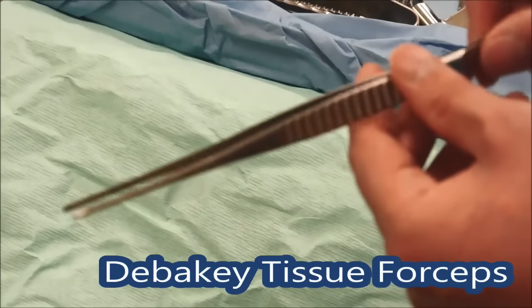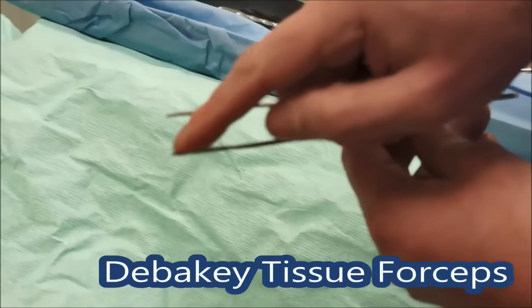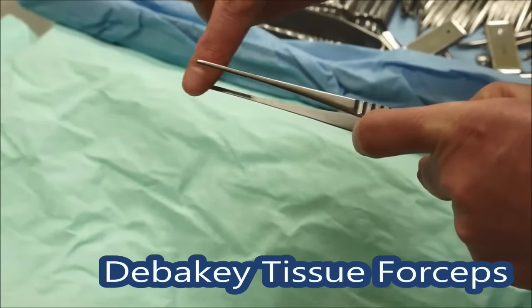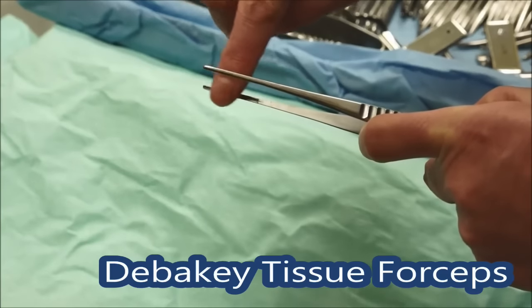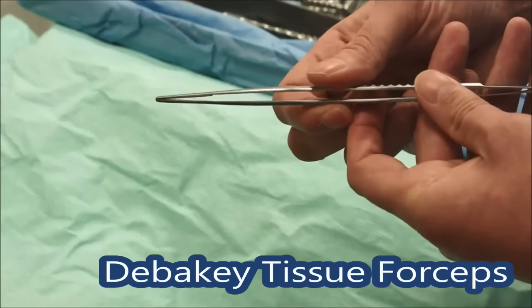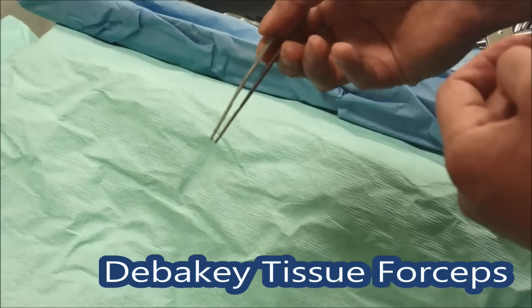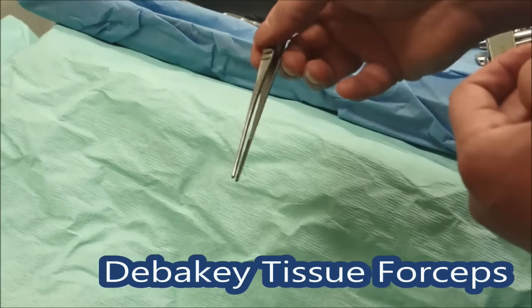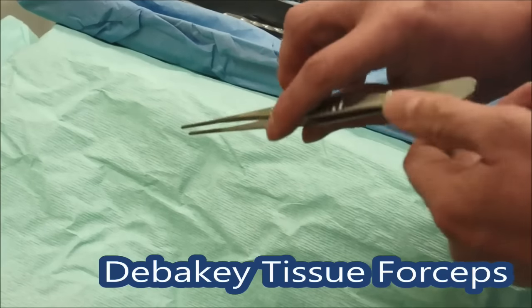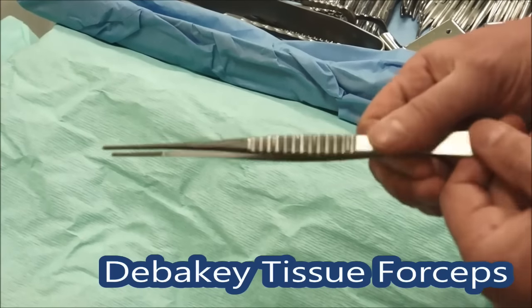Next we've got a long pair of DeBakey forceps. These are quite atraumatic forceps used a lot in vascular surgery. They've got a slightly ridged gripping surface but notably haven't got teeth on them. In more delicate or vascular surgery you can gently just hold the tissue with these — you can never squeeze tissue too hard as it crushes it, but you can lift it up without causing any particular trauma. So they're pretty useful things, these DeBakey forceps, in operating.